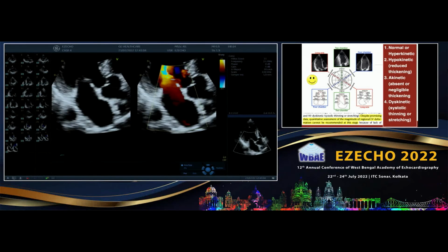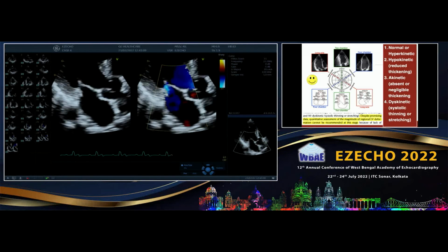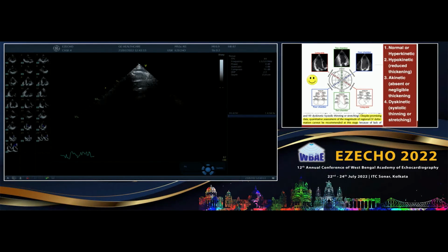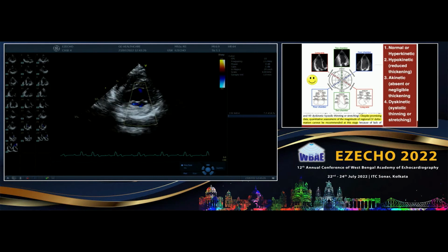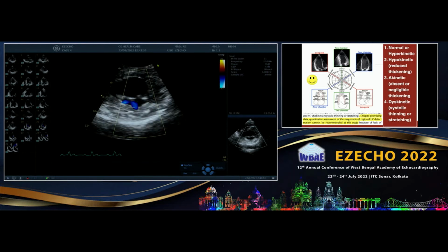Okay. Now, if you look at this MR in short axis, you will find that it is coming from the medial commissure. Just go into the short axis and you will see. This is a beautiful tenting, and the distortion of the mitral valve will be more in the medial commissure. So now put a color Doppler there. You have to see first the mitral valve orifice. Show me the mitral valve orifice. See, it's coming through the medial commissure, from the medial half. Just go down. No, just go to the mitral orifice. See, it's mainly coming from here.